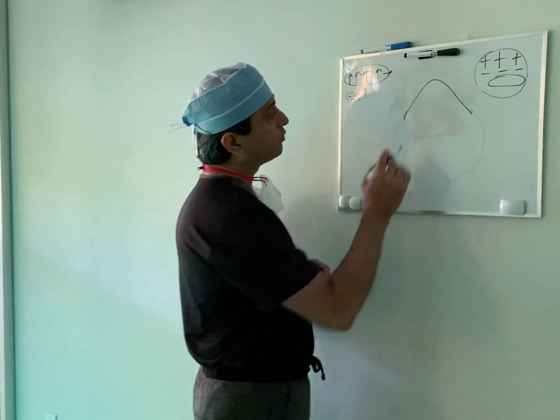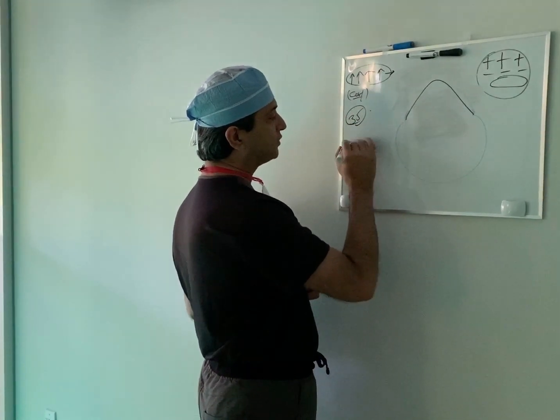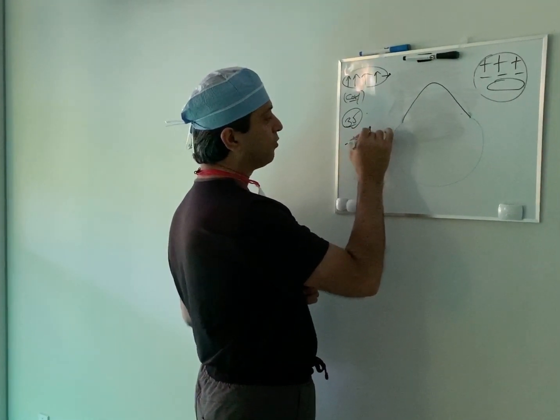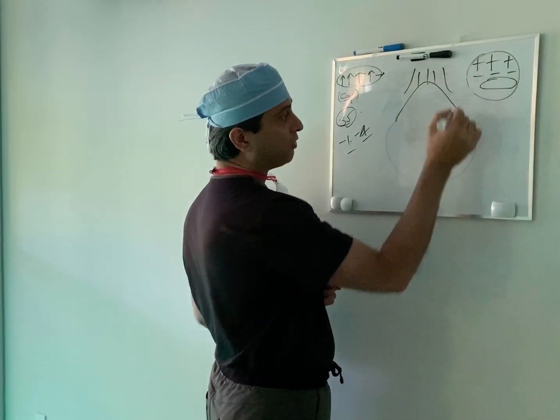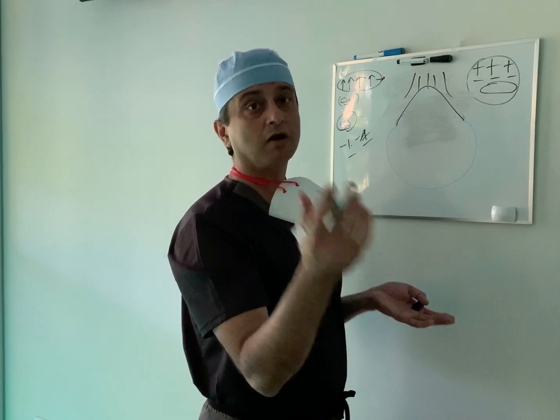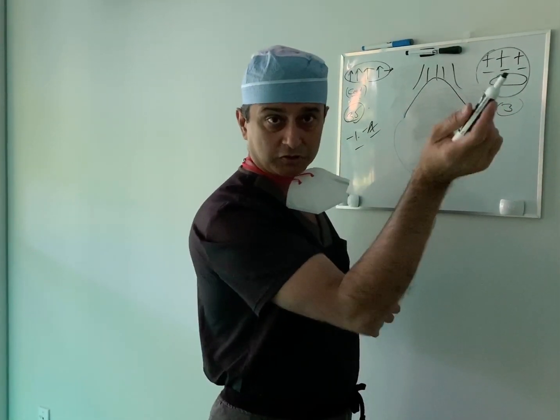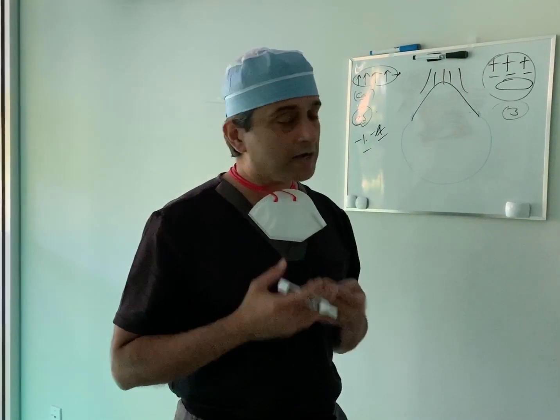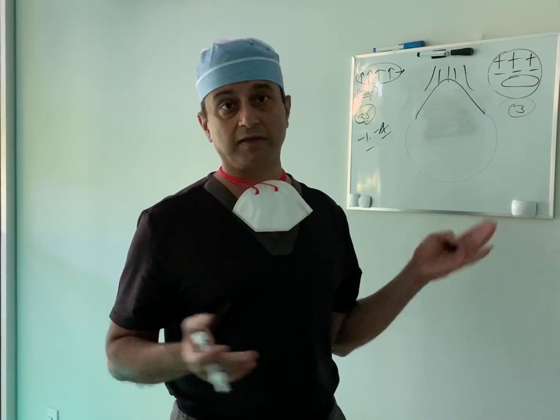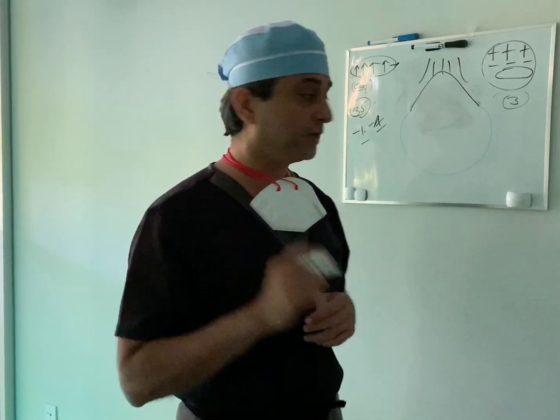So if there's a case where, let's say, the patient is 35 years old and the refraction is -1, -4, that's cylinder, that's a great case for your laser. As long as the cornea is just over 400 microns and, more importantly, stable over the last 3 years, that's how you correct that patient in 2020. Again, remember cross-linking is always there in your back pocket. I've never had to do it in 20 years of fixing K-cones like this. I use cross-linking in only those 2 scenarios I mentioned here.